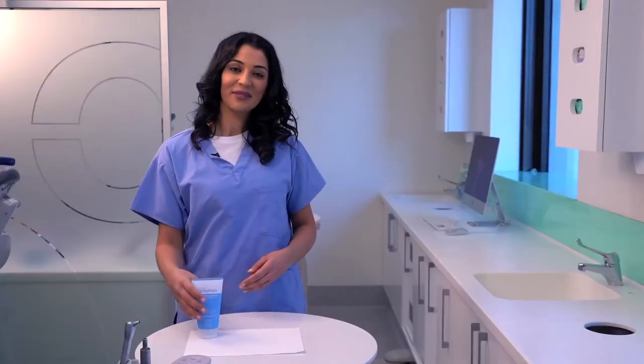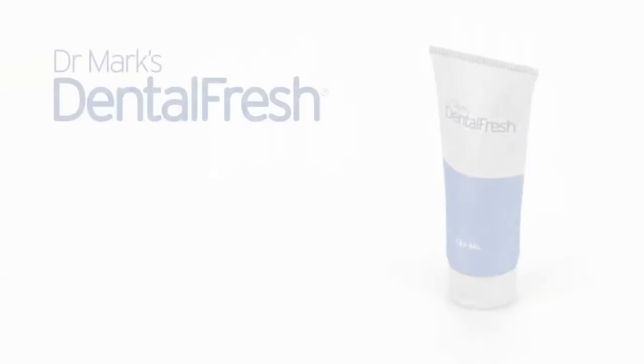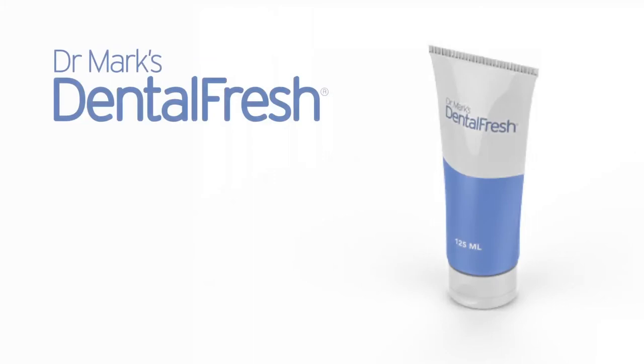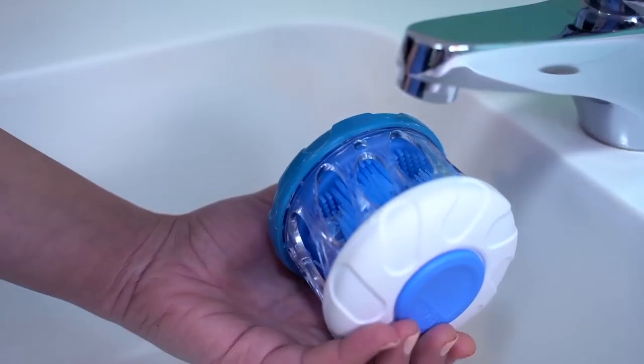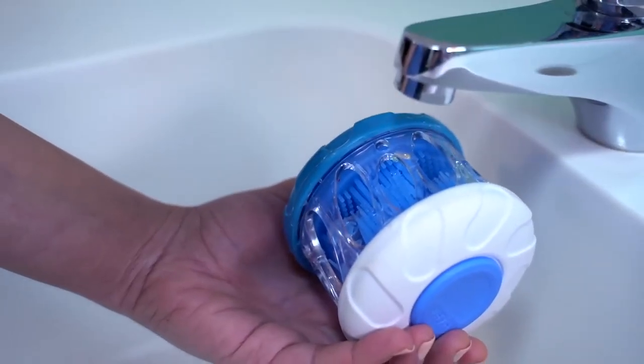Now let's apply Dental Fresh. Dental Fresh is custom formulated to clean all types of dental appliances. Three to five generous drops and a splash of water is all you need.